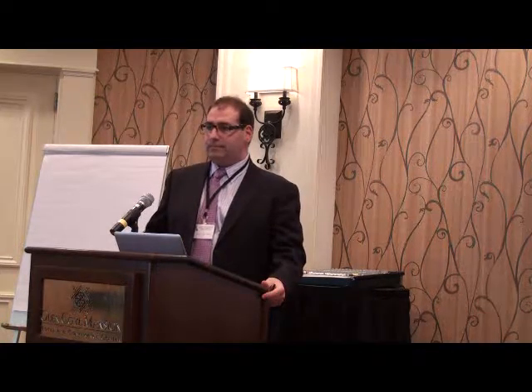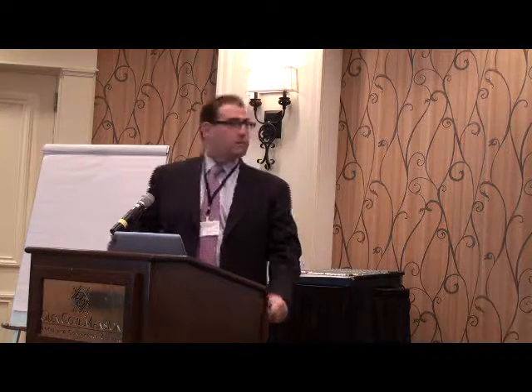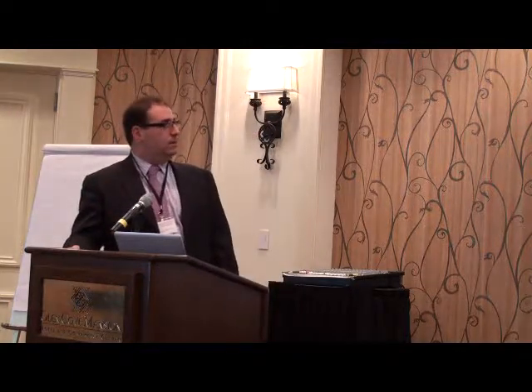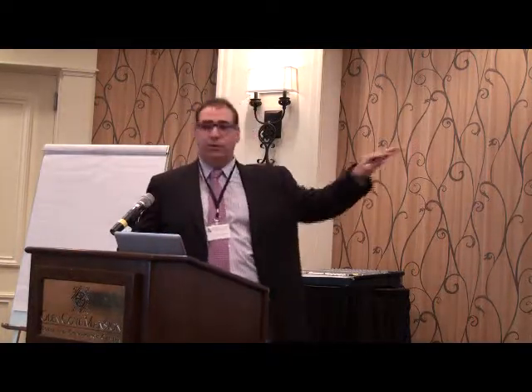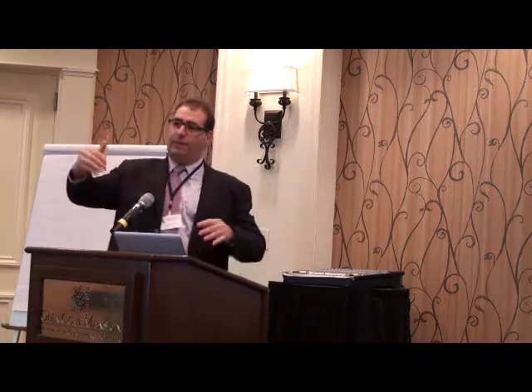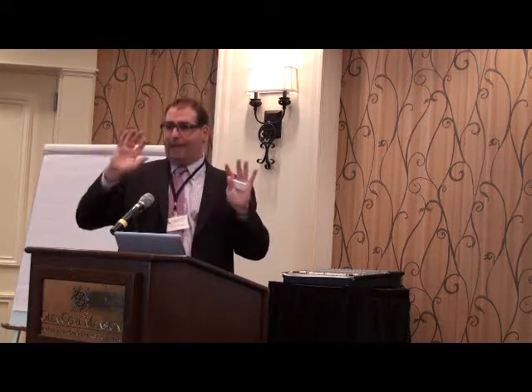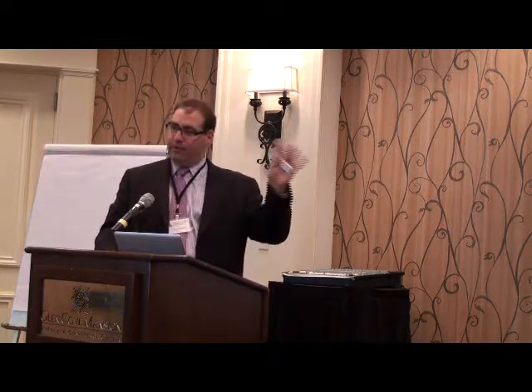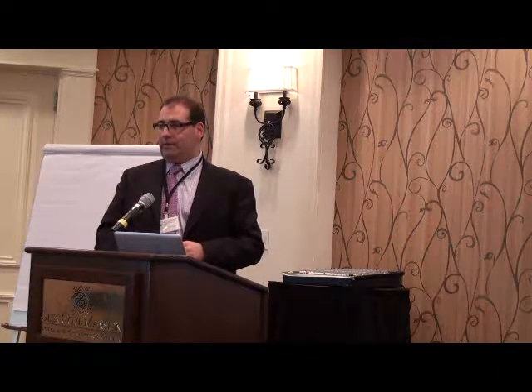Is there a number of lesions that you would say you can't do, like the one in the top right, those miliaries? No, we could. Even the diffuse bilobar disease, we would do in a lobar fashion. We would block up just the right hepatic artery, leave the left hepatic artery, and then come back in 6 weeks and do the left hepatic artery. So diffuse disease involving both sides of the liver can be done embolically.